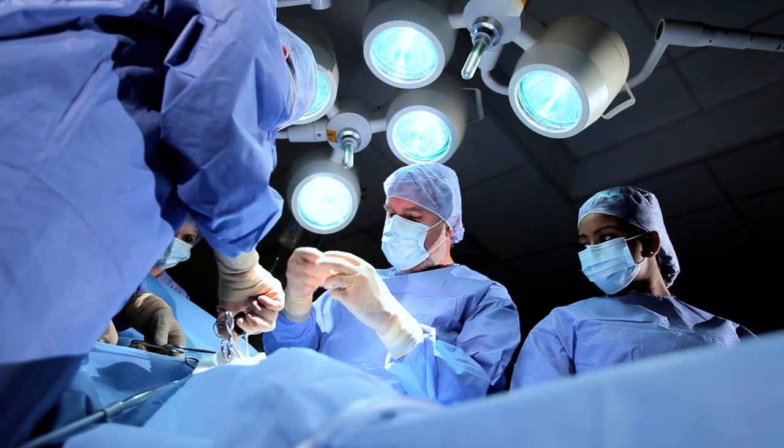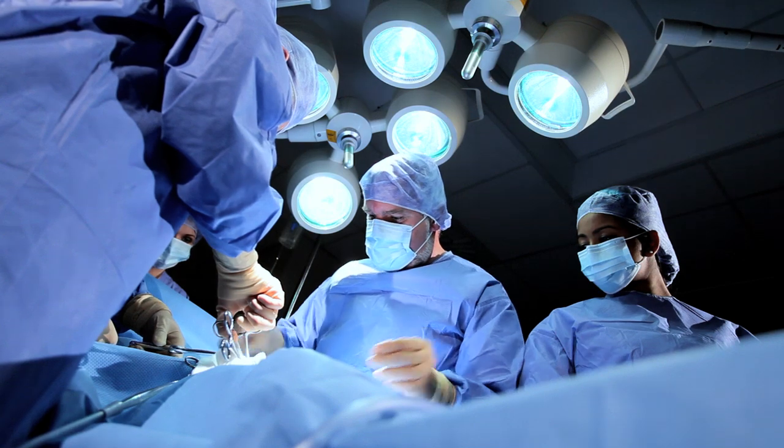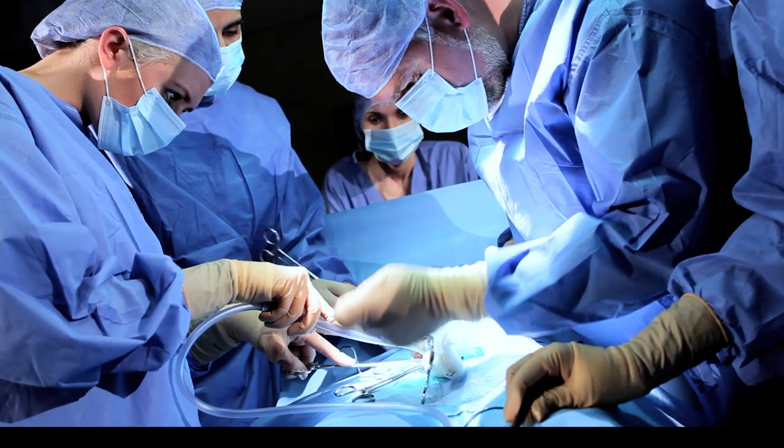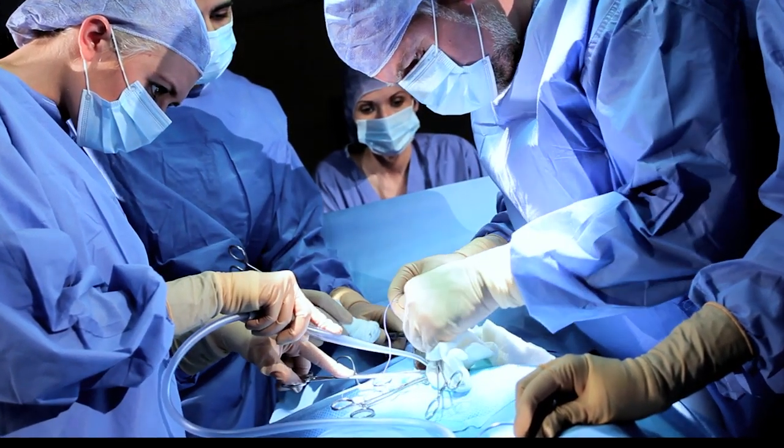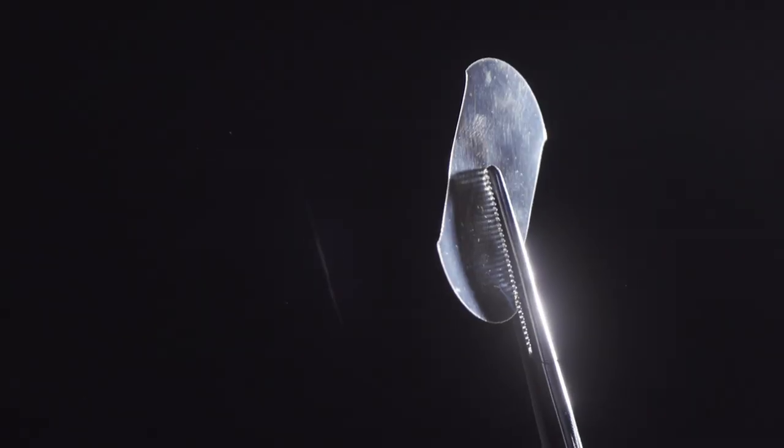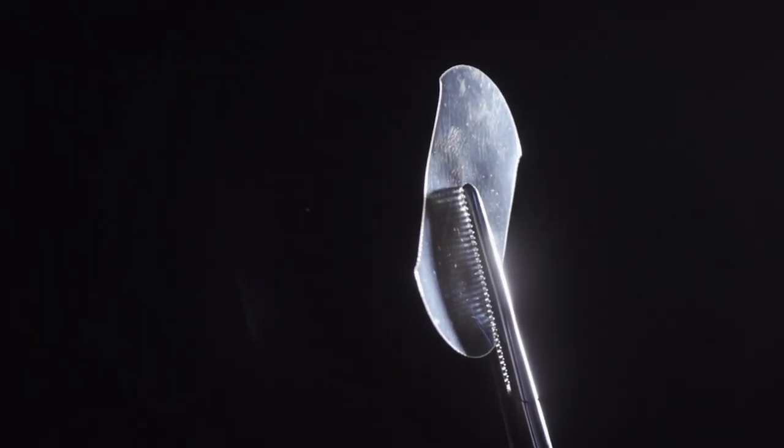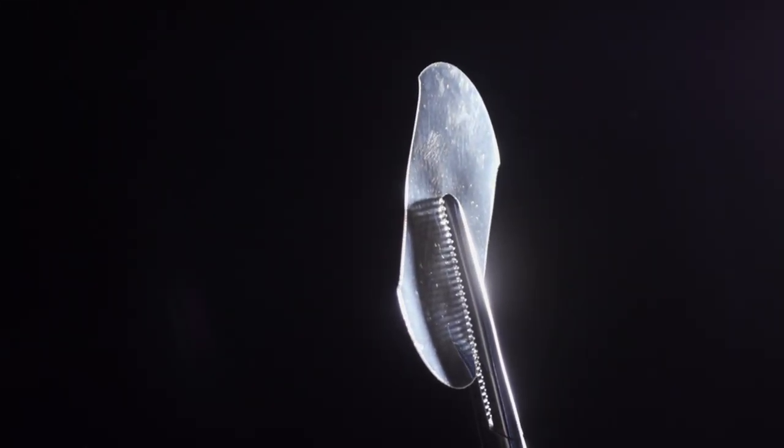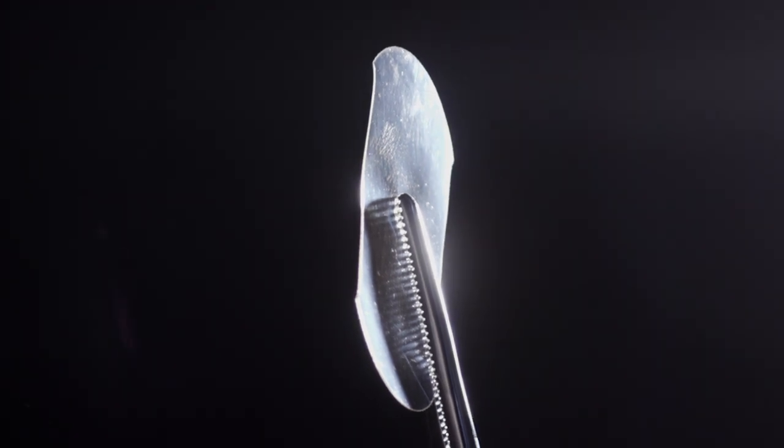There are over 230 million major surgeries each year, and most of those require suturing for wound closure. Our group at MIT invented a new bioadhesive tape, potentially replacing or supplementing existing suturing.